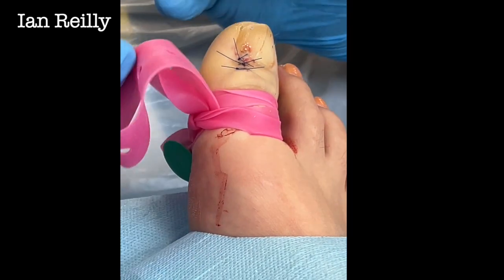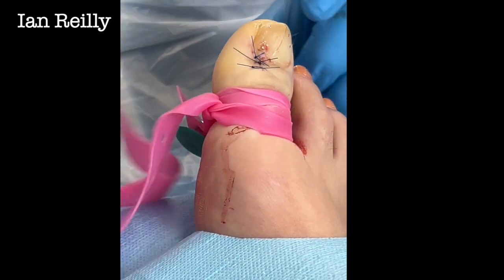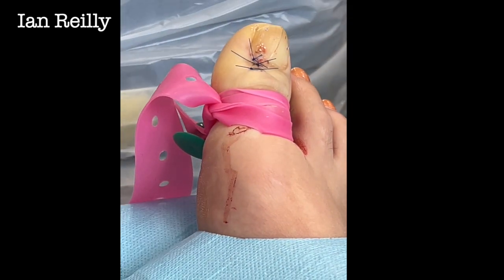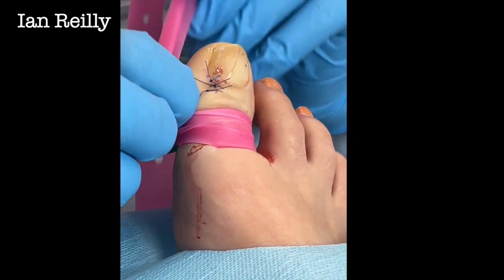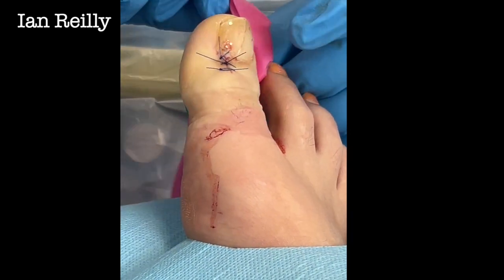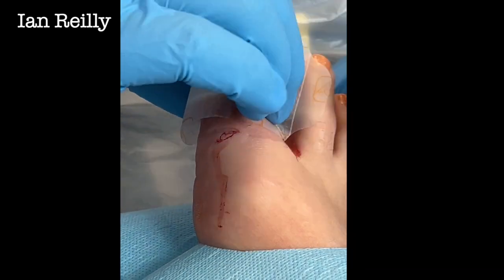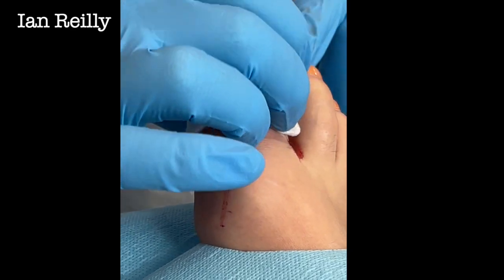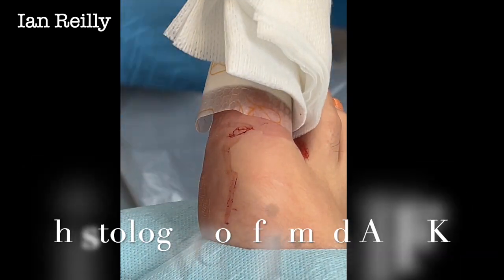We'll see how that goes bleeding-wise — hopefully not too much. So I'll put a little simple bandage on there; it doesn't need anything too clever really. I'm going to get this lady back for stitches out in one week, but we need to chase up at three months to see how we go. All done — well done you. Thank you for the video.